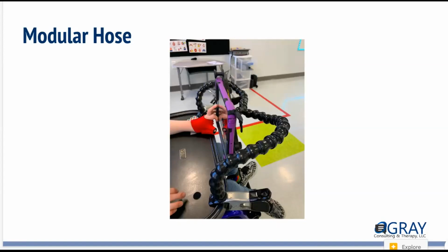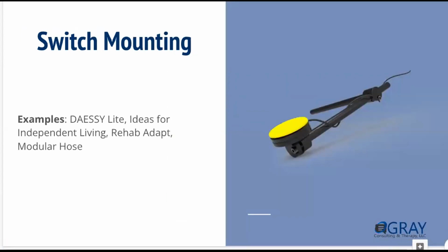I don't like the creaky sound that it makes. And individuals with a lot of tone or force in their overshooting movements will move the device in and out of position. So if you need movement, that might be good. If you want it to stay still, not so great.